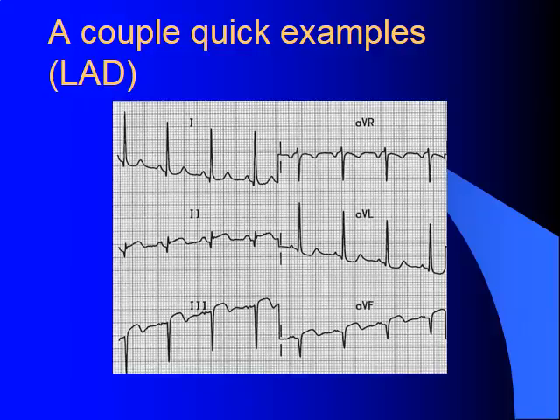Also, it is important to note that most of the time, your smallest amplitude of QRS is going to be the most equiphasic. If you look at leads 1, 2, and 3, AVR, AVL, and AVF, they all have pretty tall deflections. Lead 1 is about 15, 20, 25 millimeters tall. In comparison, lead 2 is only about 8 millimeters tall, and lead 2 is our most equiphasic.